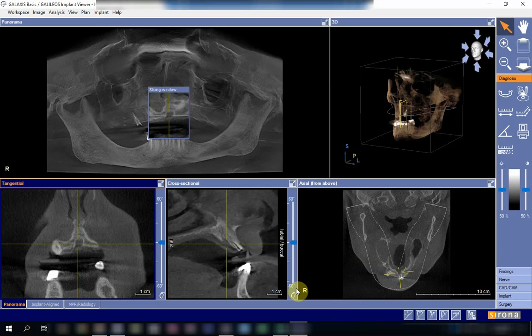Welcome again everybody to the topic of oral antral communication. In this video we're going to discuss the appearance of oral antral communication using the cone beam CT. As we know, the CBCT offers the viewer a three-dimensional image of the structures.